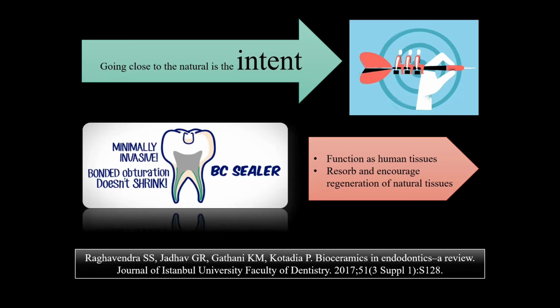Ten years ago, when bioceramic materials came into the market, it gave a clear view on why the single cone technique did not work, and it was mainly due to the sealers. The technique for obturation with bioceramic sealers is known as hydraulic condensation. Now, in hydraulic condensation, what exactly happens is the bioceramic sealer doesn't act as a sealer but acts as a root canal filler, and the gutta-percha is merely a carrier.